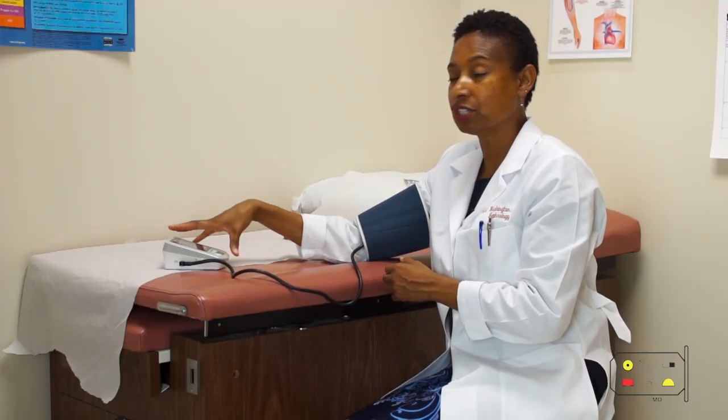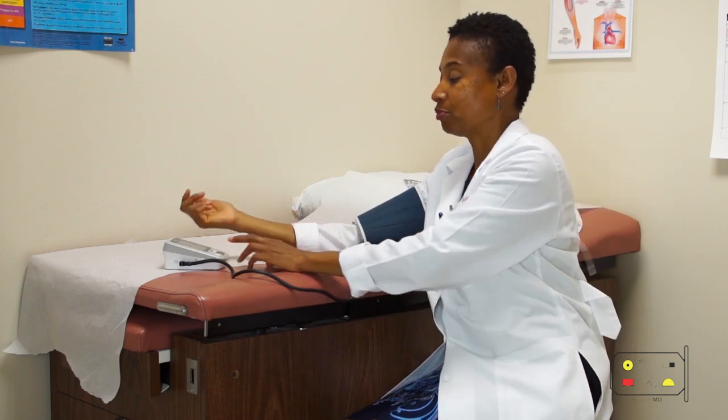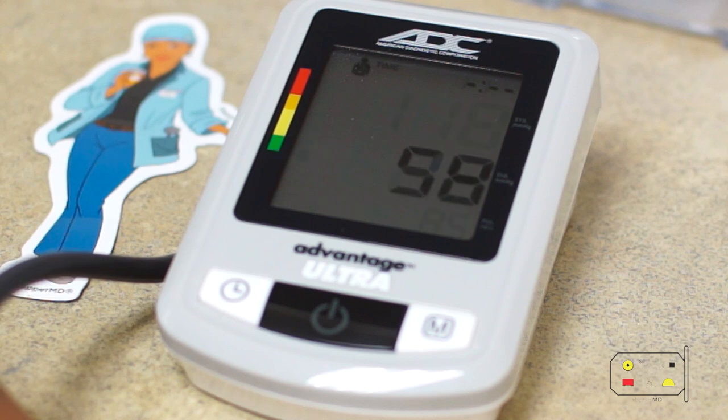And what I love about these digital blood pressure monitors is that whether you have arthritis, it's just a push of a button and it records your blood pressure reading. The top number is the systolic. That's the number, as the cuff is inflating, it's going to collapse my artery. That number you want to be, again, under 130, ideally under 120.